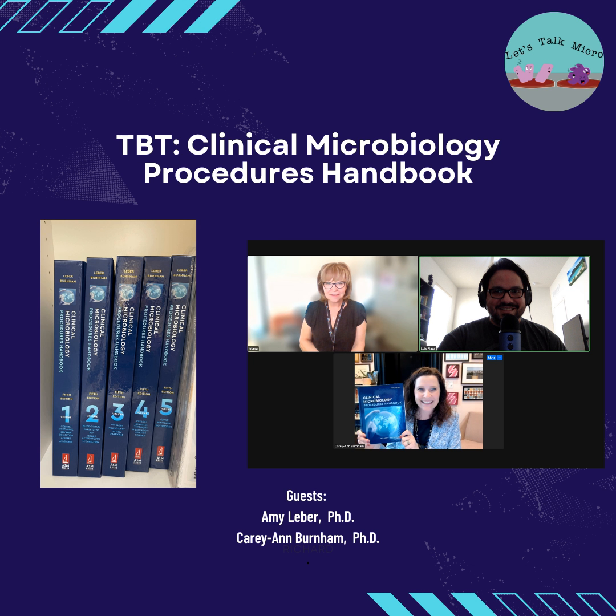There were a couple of brand new sections for the book, and they were content that existed in the book in a kind of more compact way before, but now they're new sections. One of the new sections is about blood cultures, really recognizing blood cultures are a very high volume specimen in the lab. And now there are so many things that are done with positive blood cultures, molecular tests, rapid phenotypic tests, and we wanted to really highlight the workflow across that.